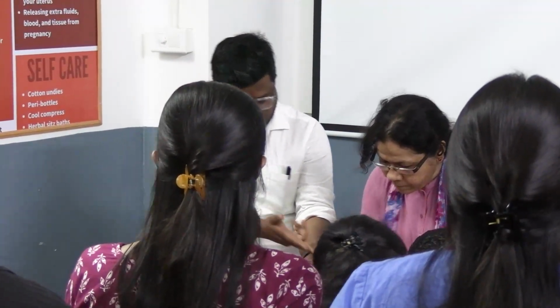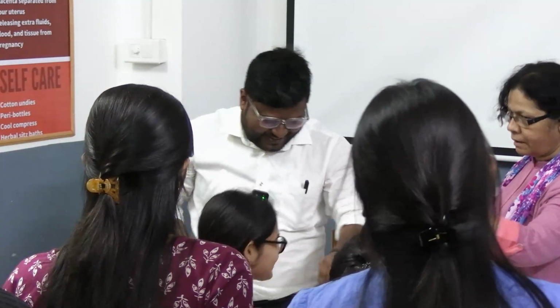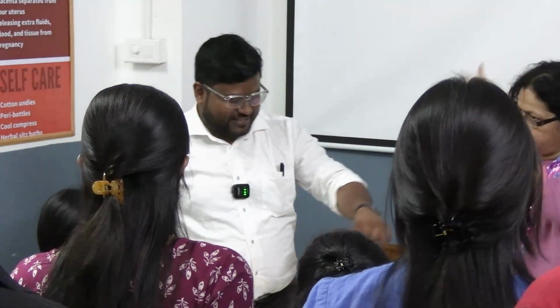Like this. Your scissors should move on top of your fingers. No nails, please. It should go down. See, no nails. Somebody else hold this while you do surgery. Come here. Your turn. One holds, one does.